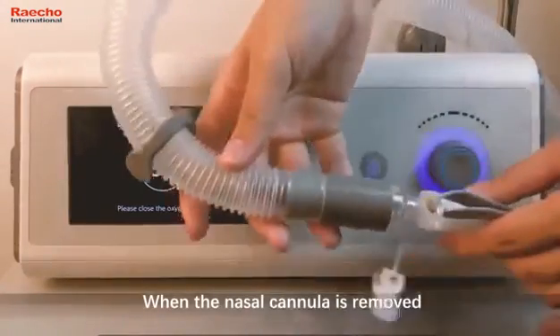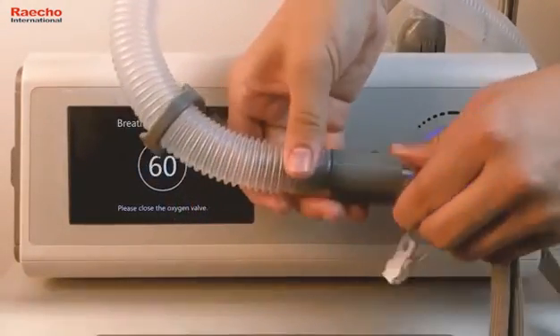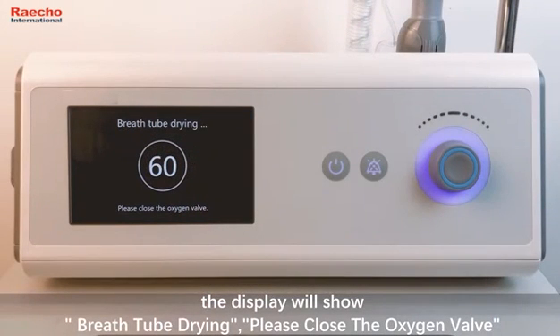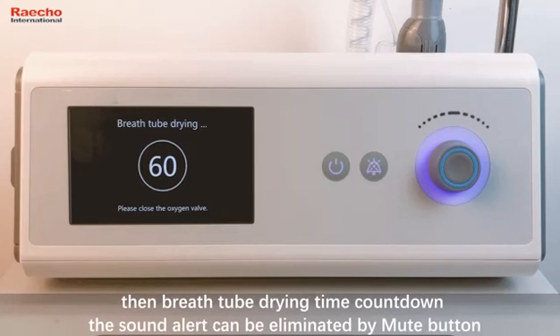When the nasal cannula is removed, the display will show breath tube drying. Please close the oxygen valve. Then breath tube drying time countdown. The sound alert can be eliminated by mute button.